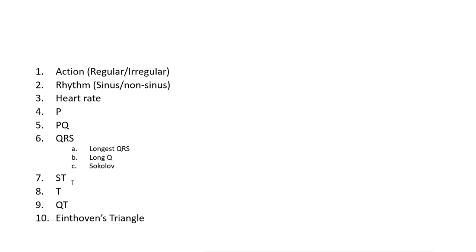We won't be seeing all the ST elevation, T inversion, QT, all items, in this seminar, but you'll be doing it when you are practicing the 50 examples of ECG. I stress again, be systematic and use these 10 points. It is very, very helpful, and it is for your own ease. It's for your own sake. Just stick with these 10 points, remember them off by heart and just tackle like that. Go through the 10 points.